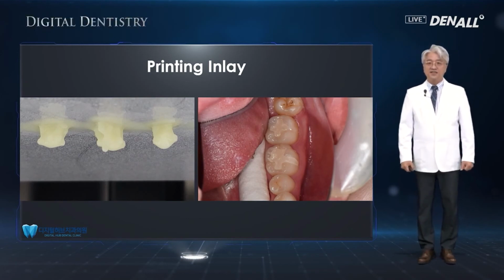Now, I talked to you about the one-day inlay design. So let's answer some of the questions you might have through the Q&A session.